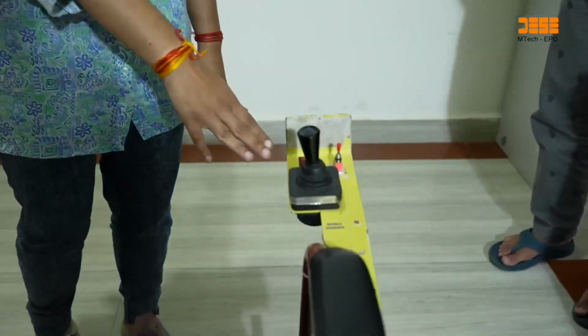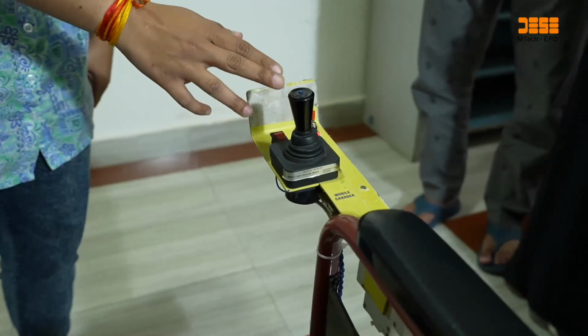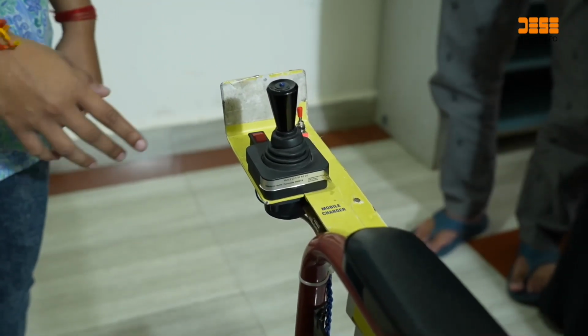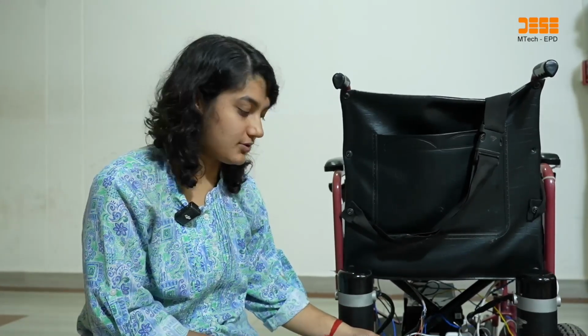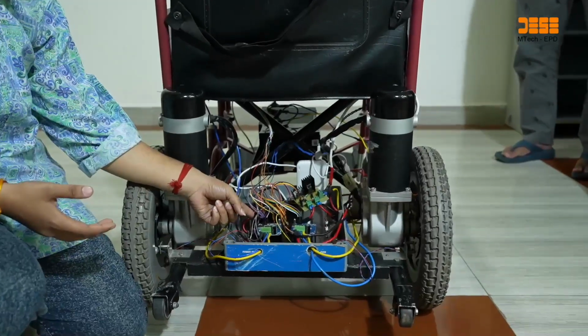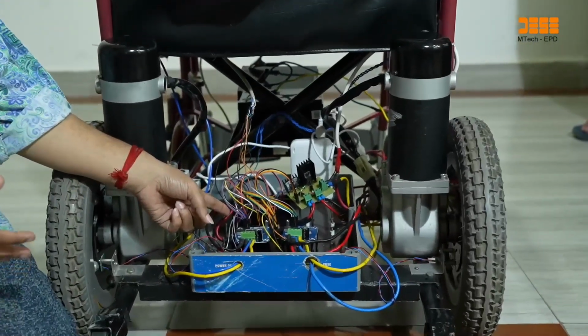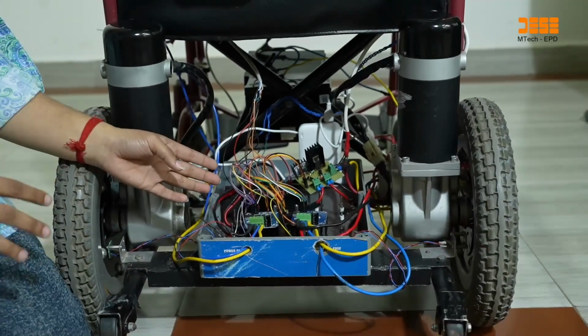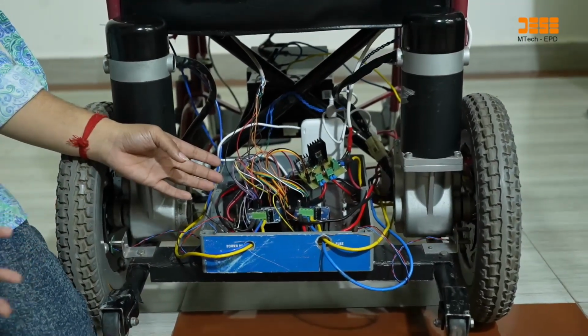So our wheelchair is majorly controlled by the joystick. This joystick is a Hall sensor based joystick, and it gives us the values for deflections in the X and Y directions. The joystick is an analog based joystick, so it gives us analog values, and for processing it in RPi we need digital values. So hence we are using this MCP3008 ADC, which gives us the digital values from 0 to 1024 and helps us to map the values of the joystick into a set RPM value.